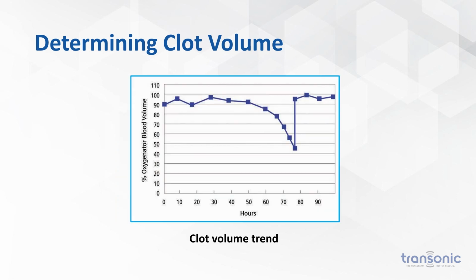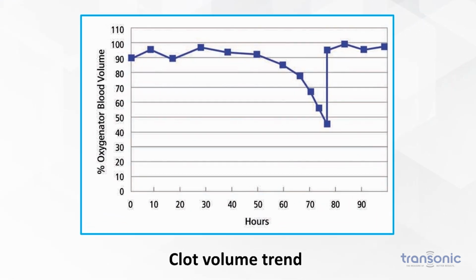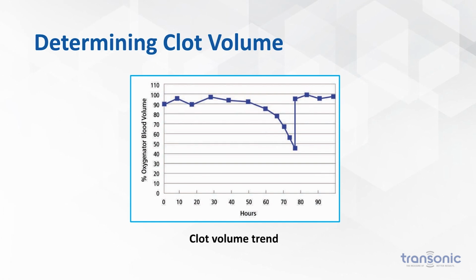It'll also trend over time. You'll see how they'll have the same volume, and it will decrease as the clot grows. Whether or not you can see it in the front, whether or not there's a pressure difference, you will see the shift in the volume.